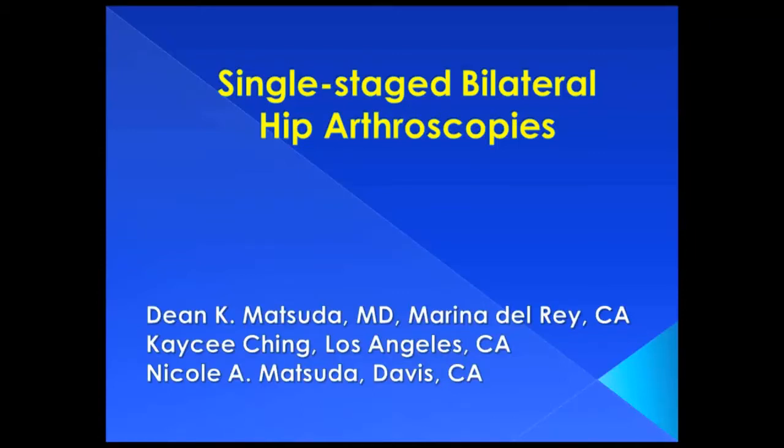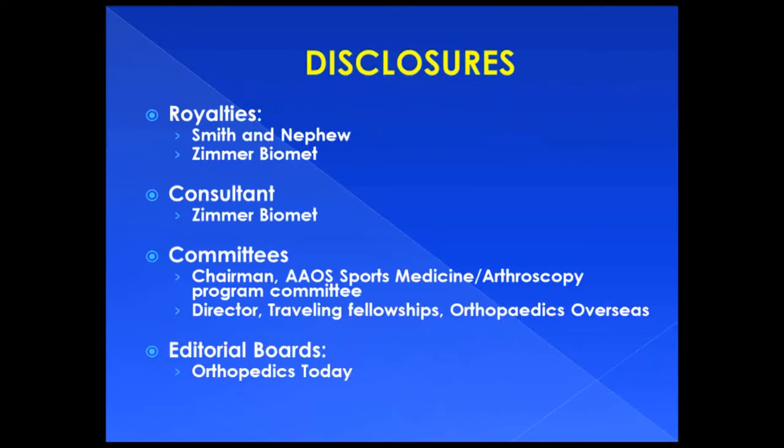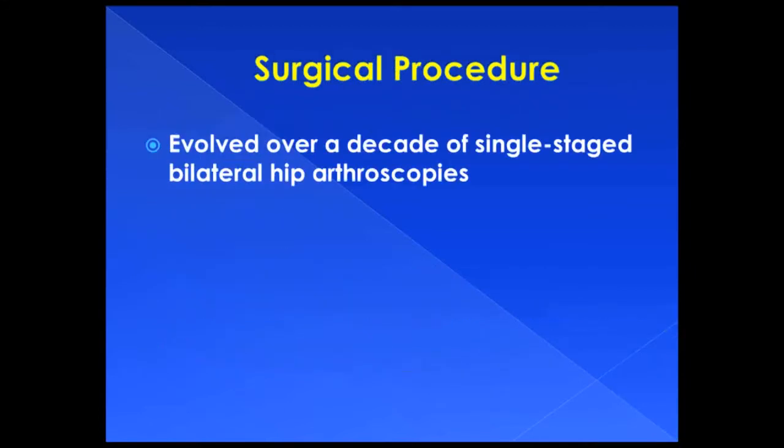The following video highlights key steps for simultaneous or single-staged bilateral hip arthroscopies, learned from almost a decade of experience.